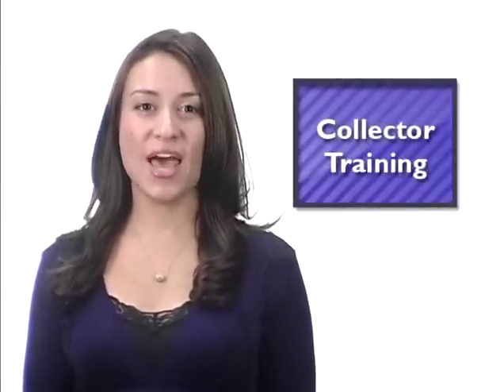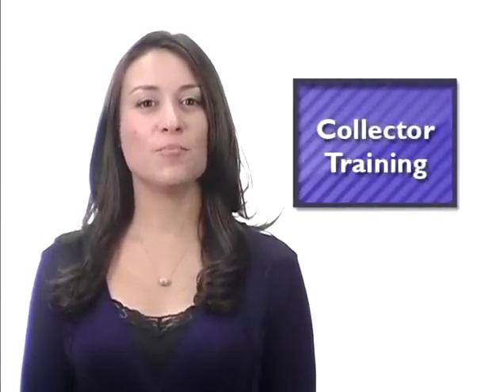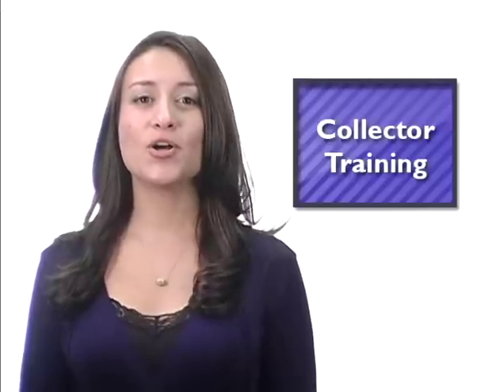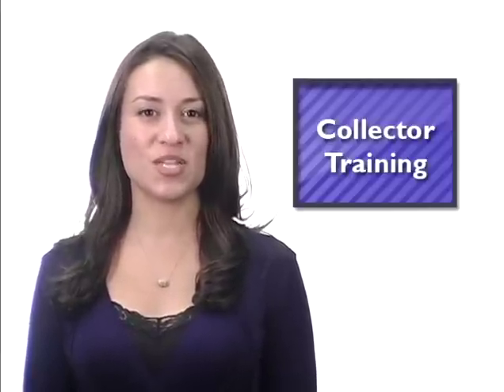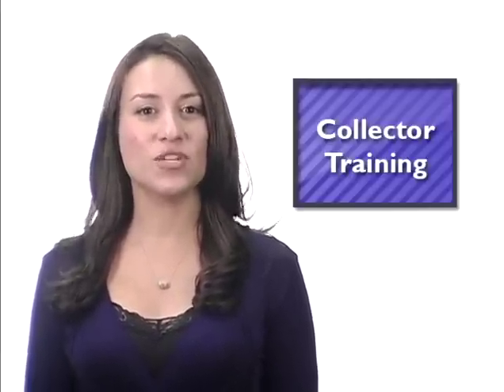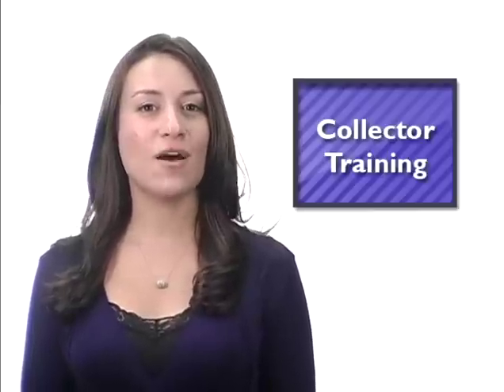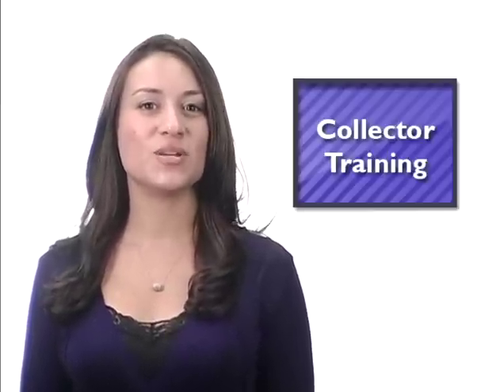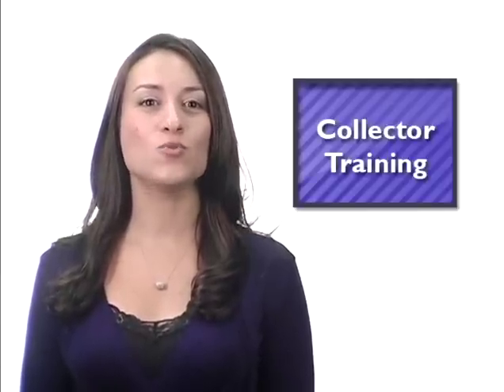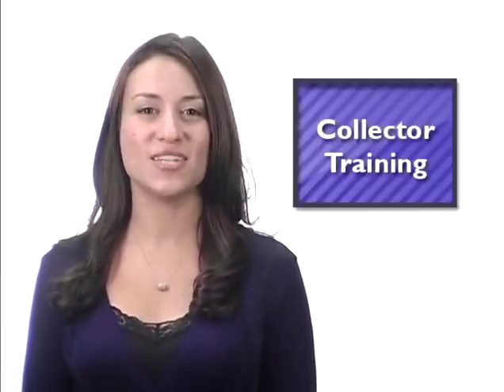Directly observed collections, in which the collector must watch the donor urinate into a collection cup, occur in a few specific circumstances. Keith Goslin, a veteran collector at Foley Services, who conducts thousands of DOT urine specimen collections each year, will discuss when and how directly observed collections are conducted.